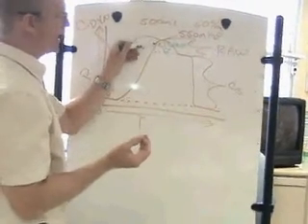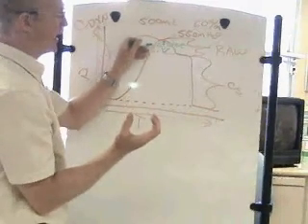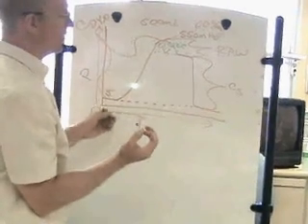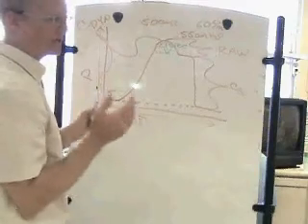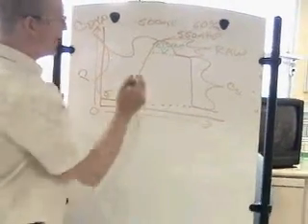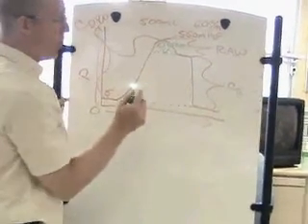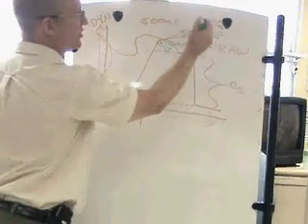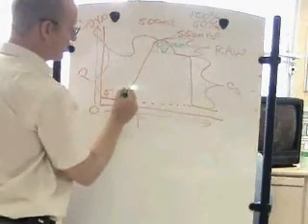If I increase the size of the endotracheal tube, make the size bigger, I will not cause as much pressure going through it because you will not have as much turbulence going through a big hole compared to a small hole. If I slow the flow rate down, I will not have as much turbulence because as flow rate decelerates, it becomes more streamlined. On the other side, if I take my endotracheal tube from a size 8 down to a size 7, or if I take my flow rate and I go from 60 liters a minute to 120 liters a minute, either one of these will cause this change.